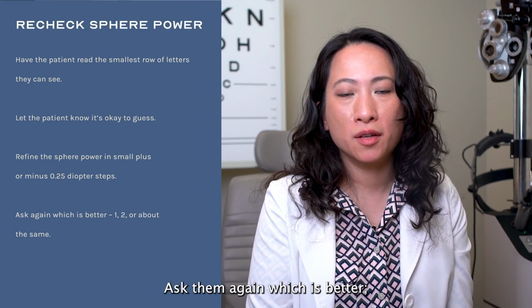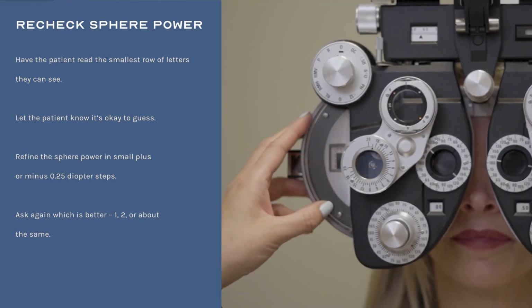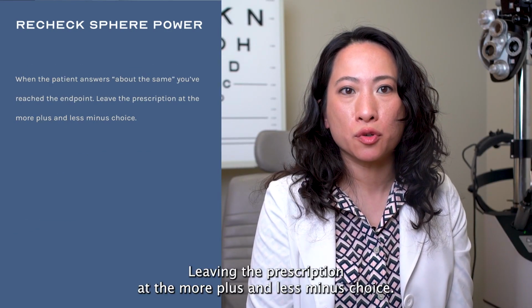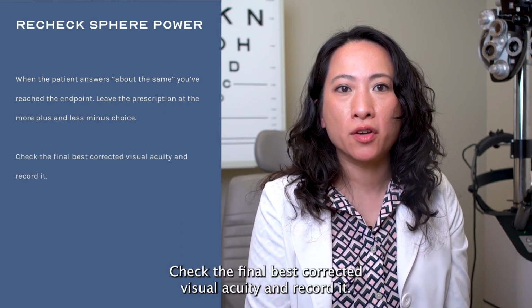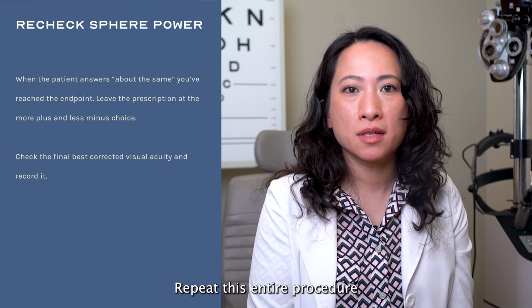Ask them, again, which is better, 1 or 2, or about the same. About the same is the endpoint, leaving the prescription at the more plus and less minus choice. Check the final best corrected visual acuity and record it. Repeat this entire procedure for the other eye.